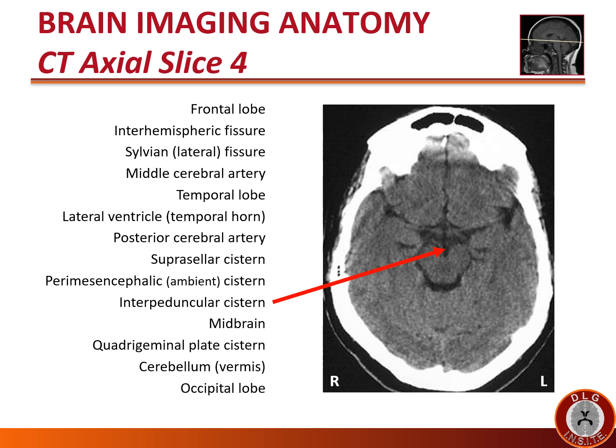The interpeduncular cistern is the small CSF space between the two cerebral peduncles of the midbrain; often you might see the top of the basilar artery here. At this level we continue to see the superior aspect of the midbrain with its distinct shape — ventrally the two rounded cerebral peduncles, and dorsally the smaller humps called the superior colliculi. Right in the middle of the two superior colliculi is a black dot, which is the sylvian aqueduct, also known as the cerebral aqueduct.